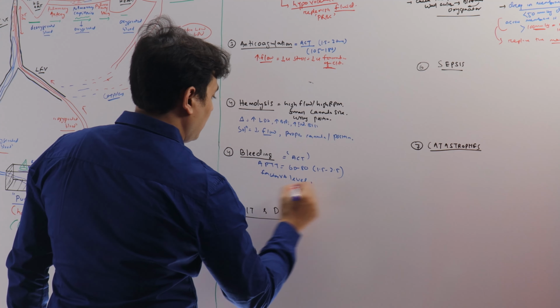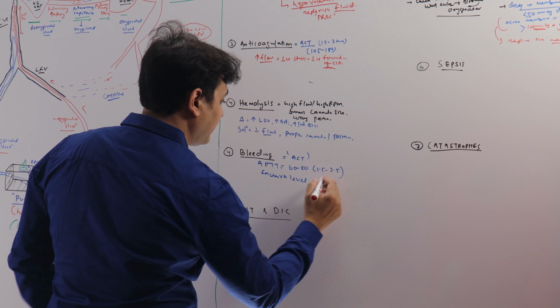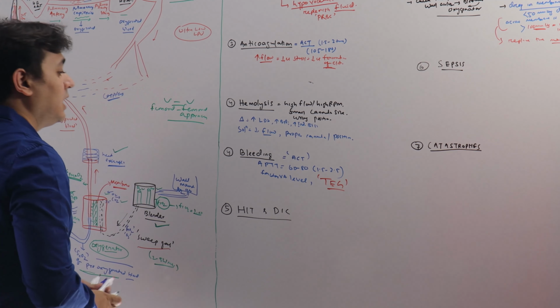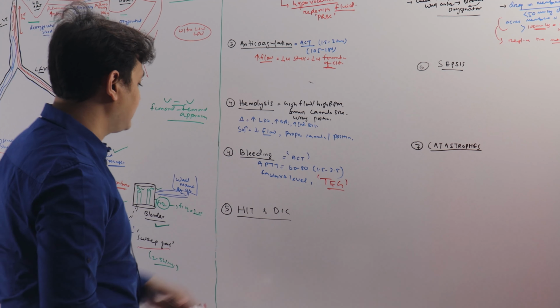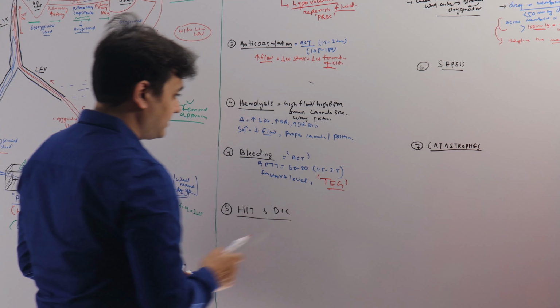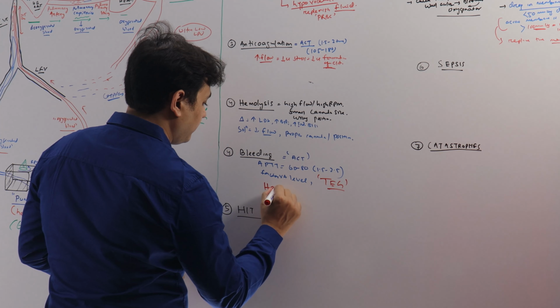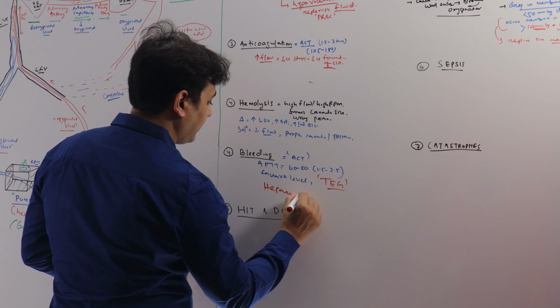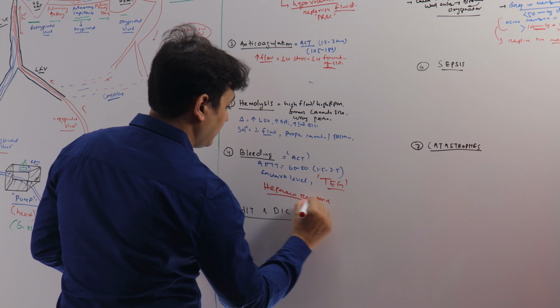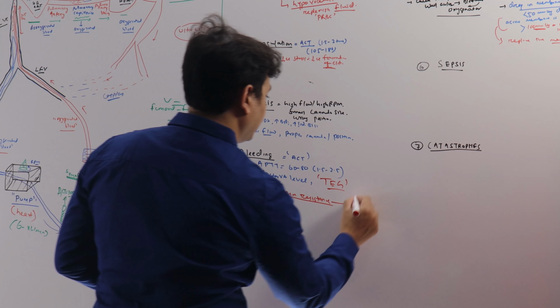right? We can also measure via the most informative TEG, thromboelastography, right? This can also help to find out what is the cause of our bleeding and take corrective measures, right? So there is another thing that happens here, that is called heparin resistance. So if there is increase in requirement of heparin, we will write it here.